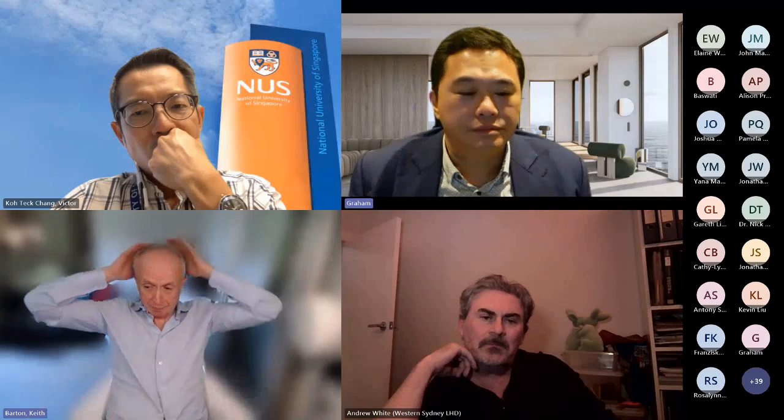Any tips on infratemporal placement? Is that your preferred second position, or do you have any other comments? Keith, what do you reckon? Look, I tend to go for nasally second, because usually there's a big plate supratemporally, and it's harder to put plates in adjacent quadrants because they bump against each other. That was especially true of Baerveldts. It's less true of PGIs because the diameter is not as much.